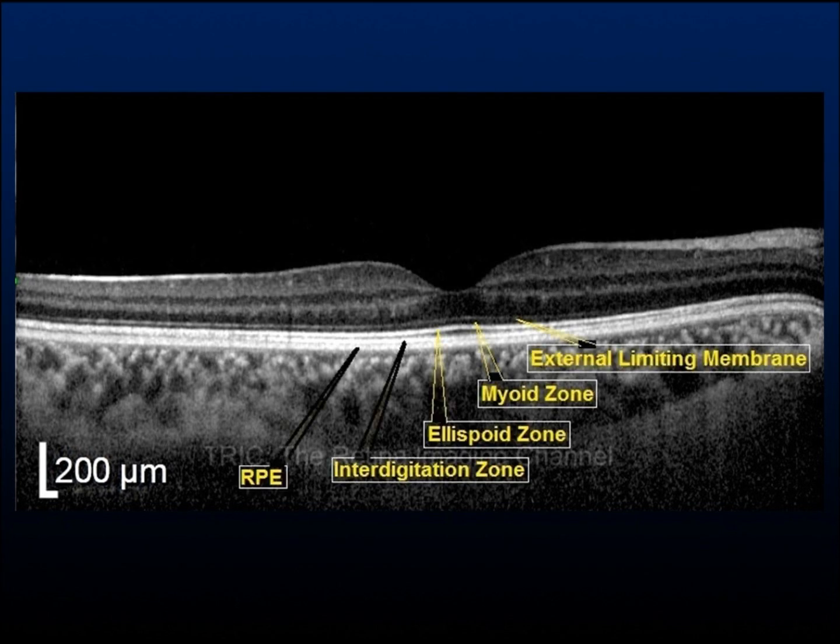Following the outer nuclear layer there is a thin hyperreflective line on OCT which is the external limiting membrane. The hyporeflective zone after the external limiting membrane is called the myoid zone. After that there is a thicker and more prominent hyperreflective band which is called the ellipsoid zone. This is the same band which was previously called the inner segment–outer segment junction; however, the current understanding is that it should be named ellipsoid zone.